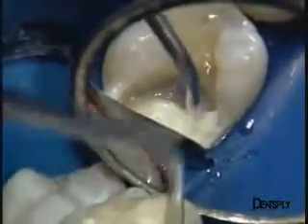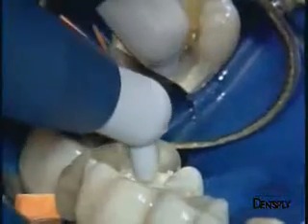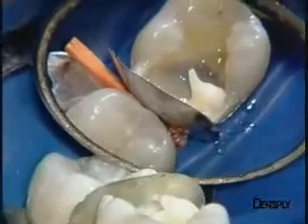Initially, Ceramix Mono is placed in the distal proximal zone, with a small extension already at the level of the distal lingual cusp which is missing. A second layer will allow reconstruction of the lingual wall, beginning with its distal portion. It also helps create the first outlines of the occlusal surface.